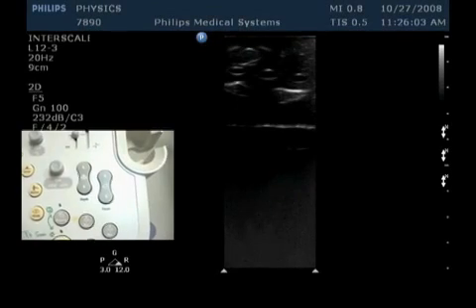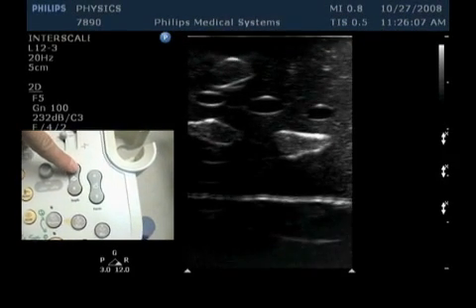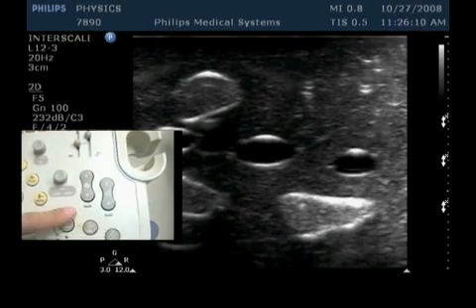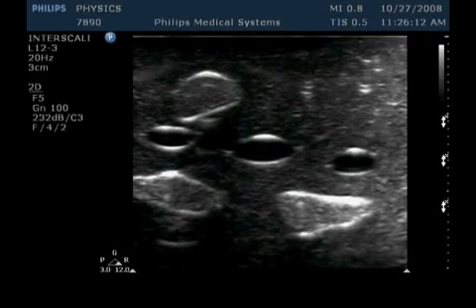The following video demonstrates the correct depth selection. It should be evident from this video that in addition to improving a machine's frame rate, selecting the appropriate depth also produces the highest quality image that is magnified.